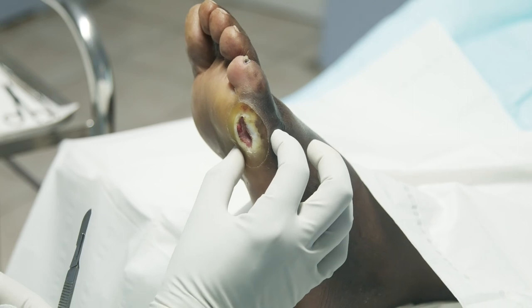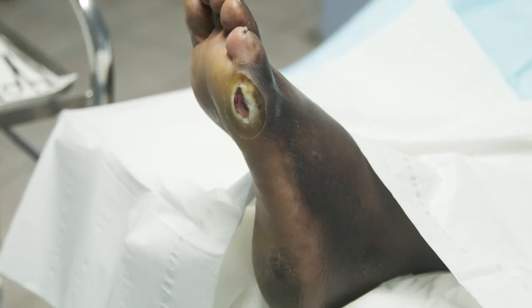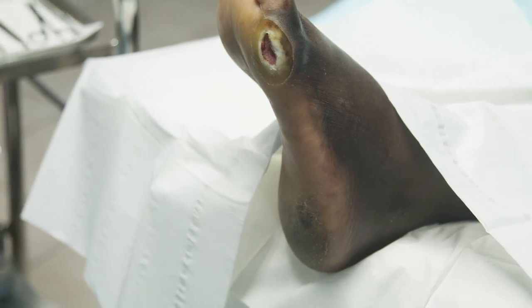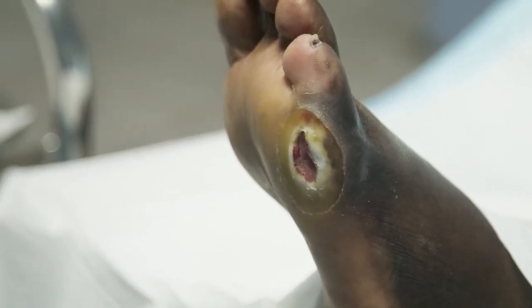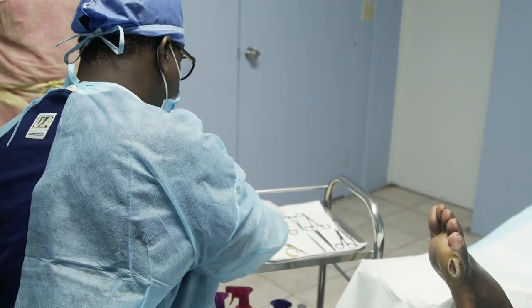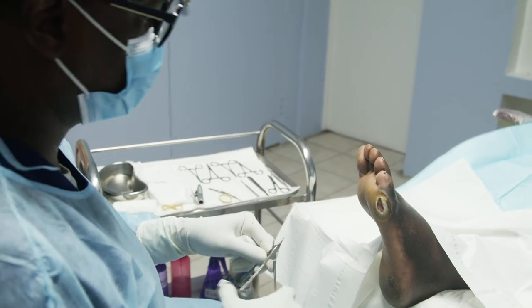And I'm now going to go inside here. These are some very clever blades we use now. Give me a 64. It's a 64 MIS blade. And these are tiny, tiny blades because I'm going in between the blood vessels and the nerves and right down to the level of the joint. And all of this work will be done inside the joint. Okay, so we're going inside the capsule now.